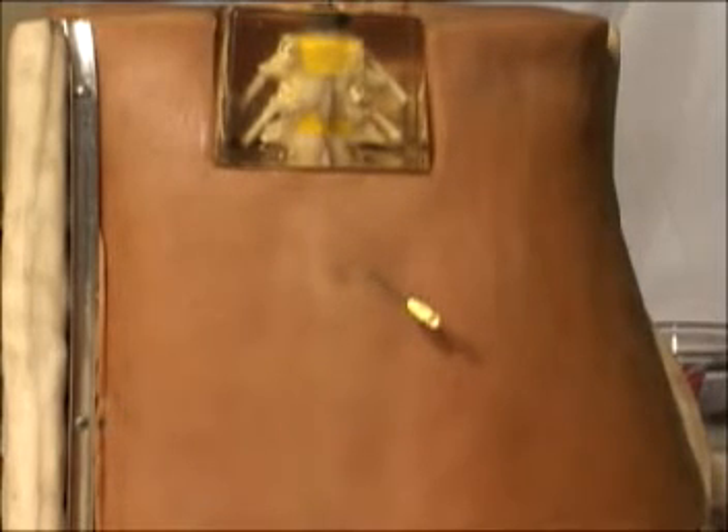Upon removal of the needle, the wound immediately heals by the pressure of the spinal fluid upon the inward opening flap, again as shown on the webpage.